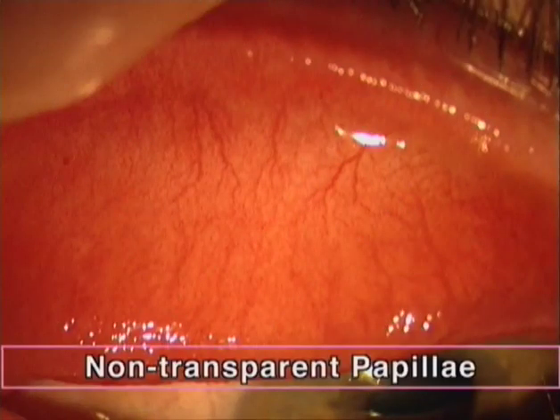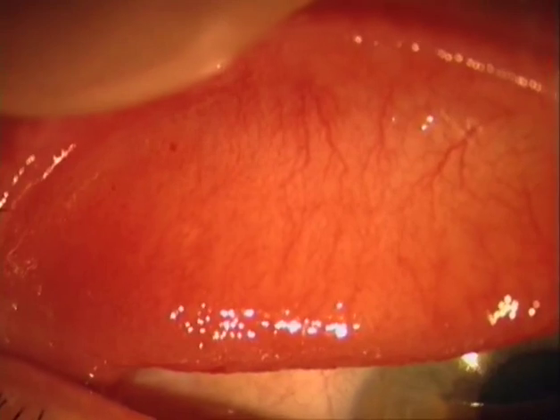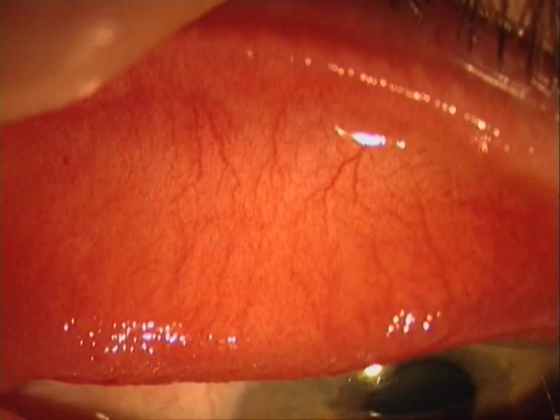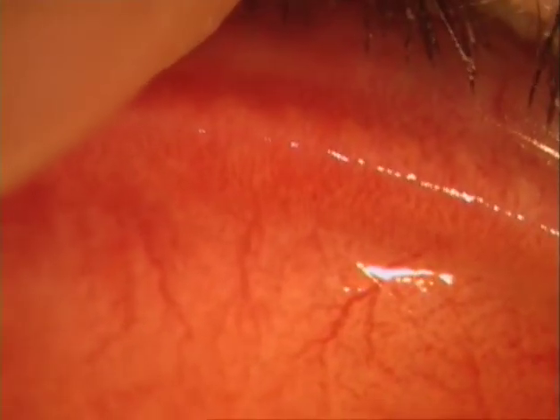Non-transparent papillae. In this next case of chronic conjunctivitis, the papillae, again recognizable by their surface reflexes, are less transparent and thus blur the view onto the underlying larger vessels. The papillae involve also the margin of the tarsus, up to the capillary palisades, and extend even across the edge of the lid margin.